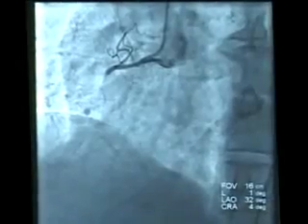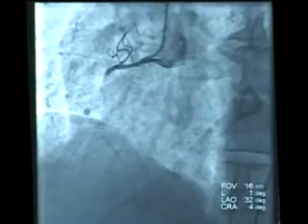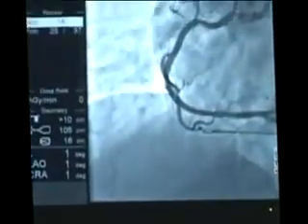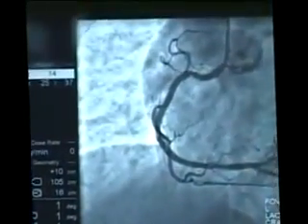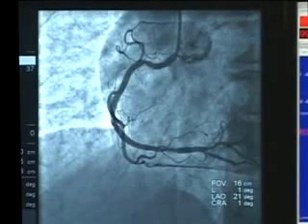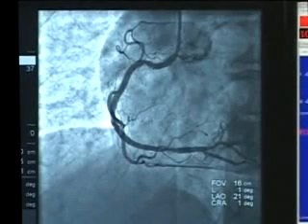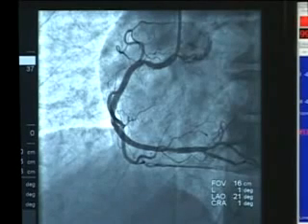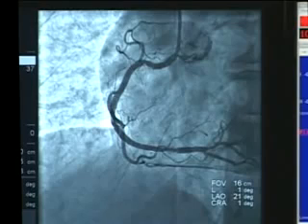That's the artery before we started, and the top image is the artery following thrombus removal, balloon angioplasty, and intracoronary stenting of the vessel. It's actually a large vessel — it can be deceiving. It looked small when we started, but it's a very large vessel.